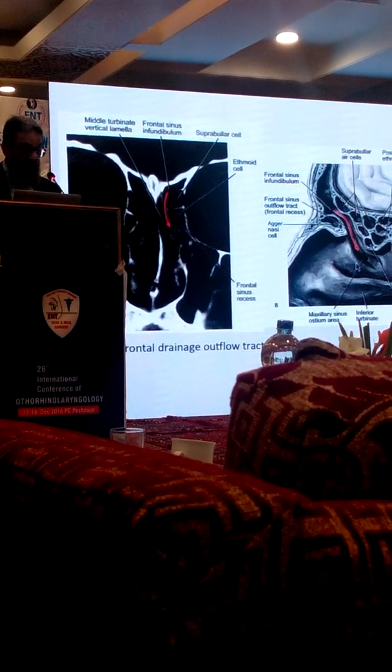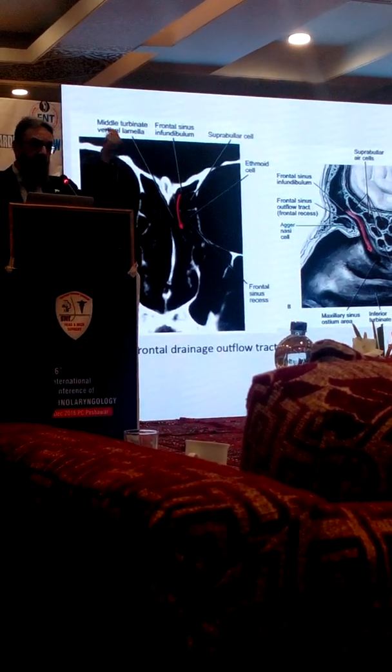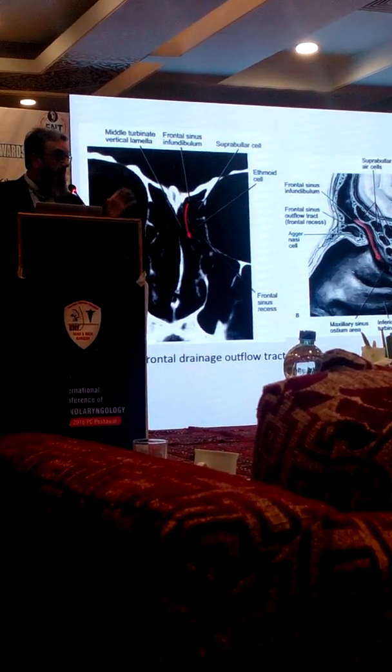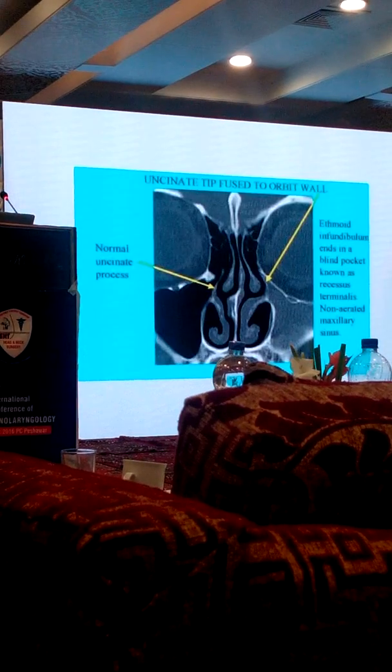We tend to just sound that area. I used to do the same previously. Just see that my probe is going into the frontal recess and I'm very happy. No, we have to remove these cells to make it a wide frontal recess. Post-operatively, there are going to be problems.